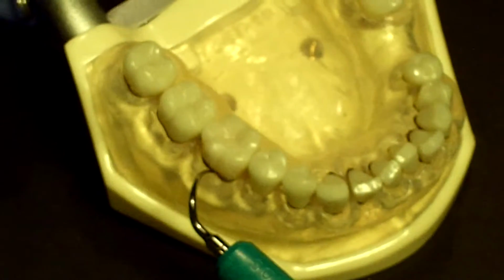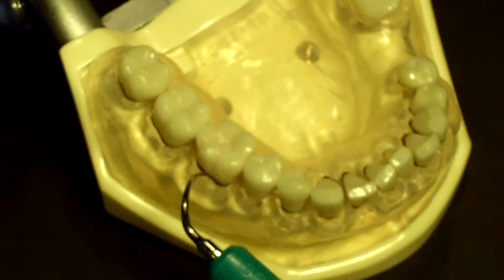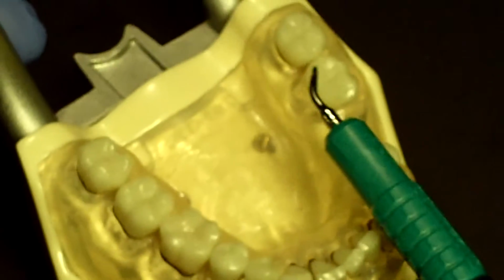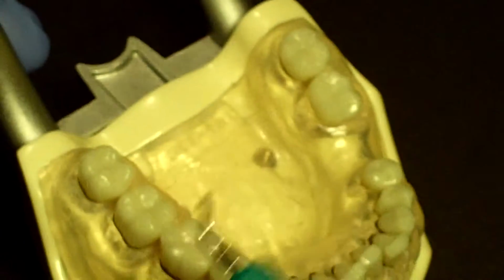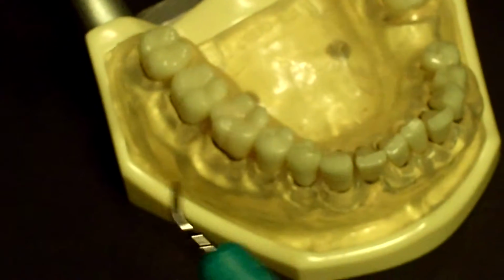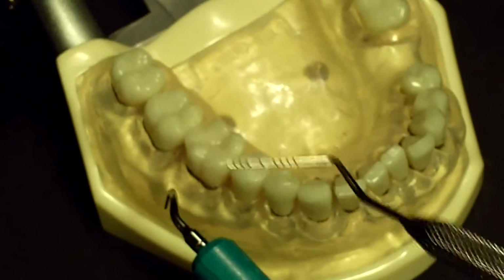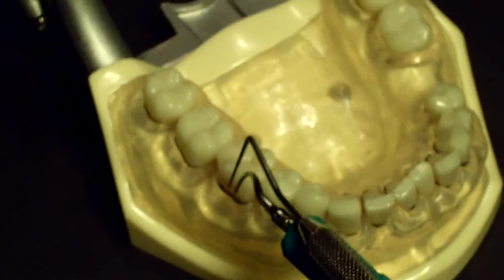Remember, you need to have the 2 millimeters of adaptation. So if we know this is the correct insert here, we're in the vertical approach, we know it's the correct insert to use in the lingual here. Keep in mind, this is again called the vertical approach. Some like to refer to it as the probe-like approach, because you're literally going in a probe fashion.